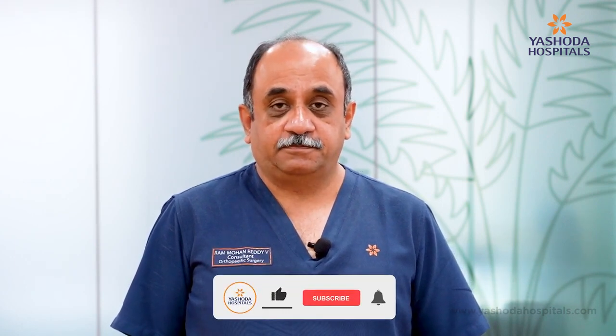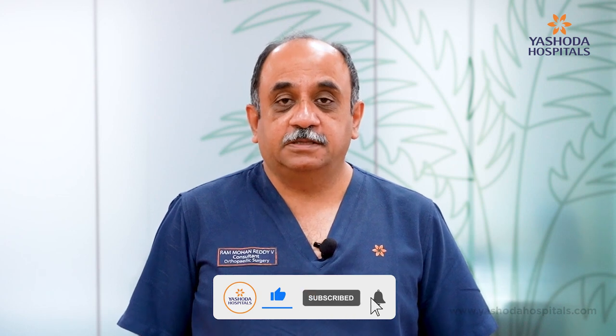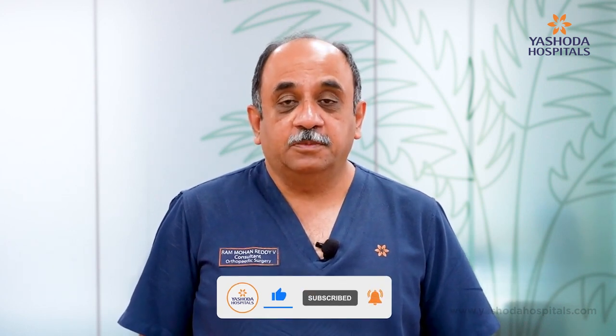The third robotic system is where the surgeon feeds in the landmarks and the robotic arm does the cuts. Here one has to be very careful. If the surgeon puts in wrong landmarks, then the robotic arm will use that landmark and can do wrong bony cuts. There can be injuries to the blood vessels, ligaments and nerves. The surgeon cannot change the landmarks once the input has been given to the robotics, which means robotics overrides the surgeon. This is one of the few robotics where one has to be very careful. Again, the implants have to be used only manufactured by that company.